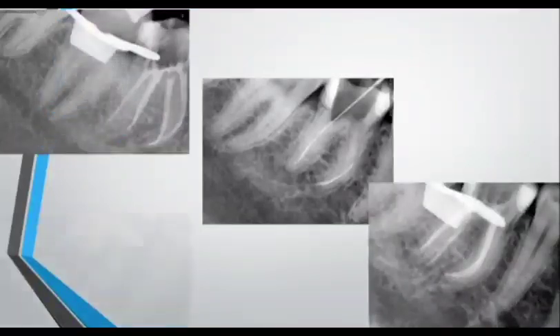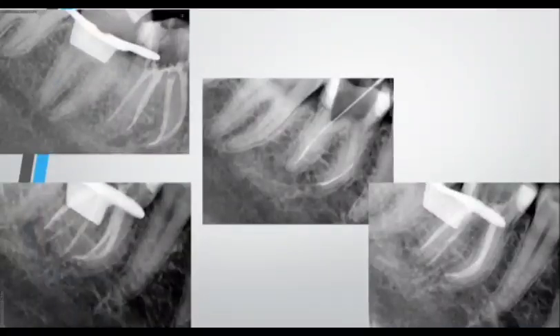In the first visit, all broken files were bypassed. In the second visit, I bypassed the ledge, and here we can see the case obturated, just like the protocol mentioned in the earlier cases.